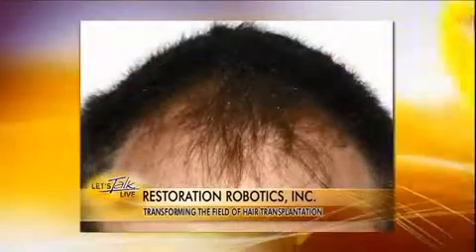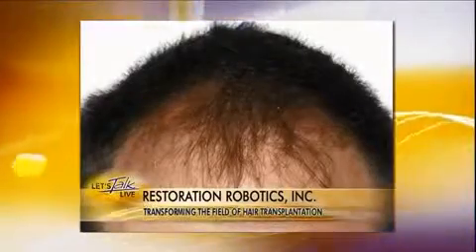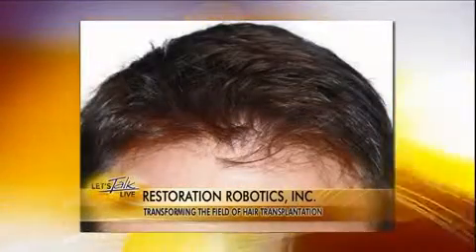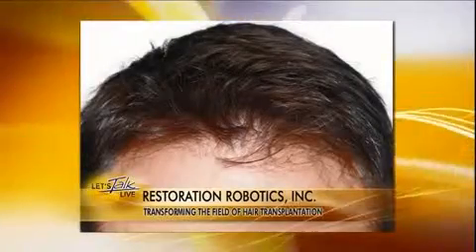So if somebody wants new hair for Christmas, can they have that? Is it that fast? How long does the whole procedure take, and how quickly can people see results? So the procedure is a half-day procedure. The full benefit of the treatment is usually appreciated 9 months to a year later, because we're actually just moving the hair follicle. The hair follicle is what produces the hair, and it takes 9 months to a year for that hair to fully grow in.